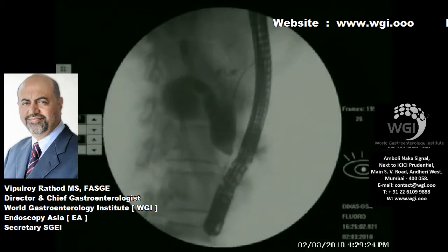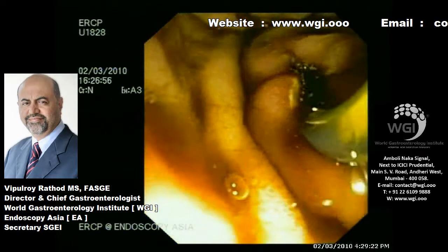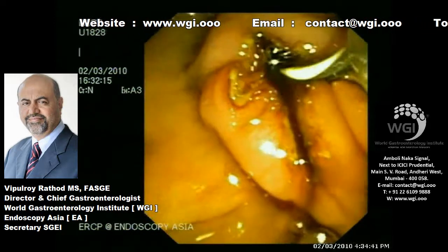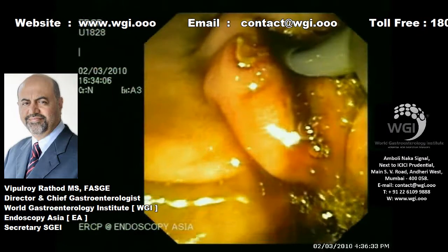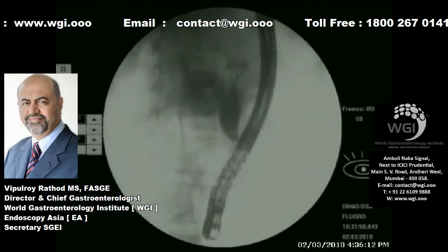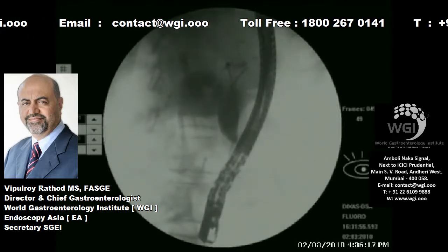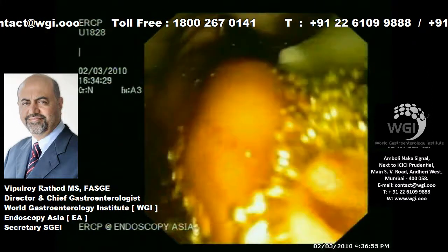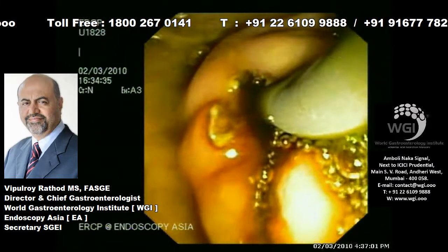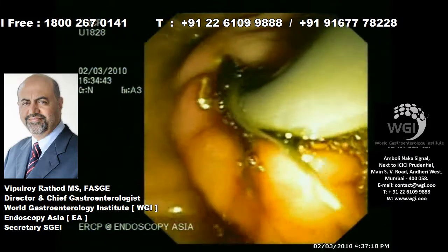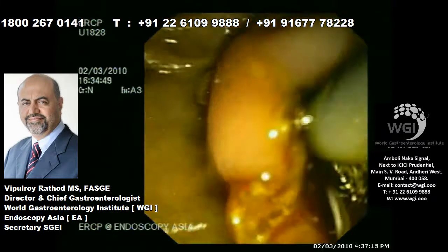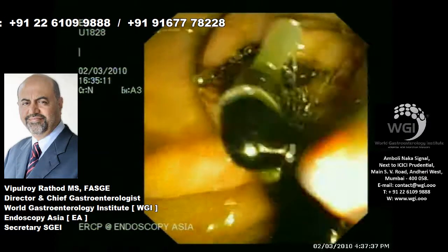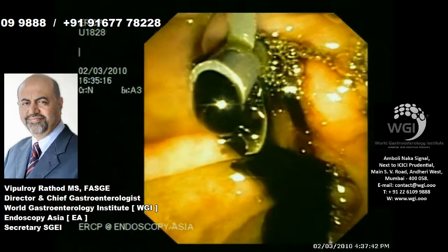Since this patient is 47 years old and the referring surgeon wanted to explore a possibility of resection — though there are lymph nodes in the peripancreatic region as well as in the celiac artery area — we feel endoscopic ultrasound will enhance our staging capability in such resectable lesions. A 10 French stent was placed, which showed free flow of dark bile.